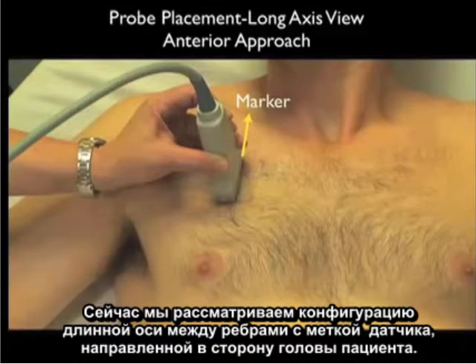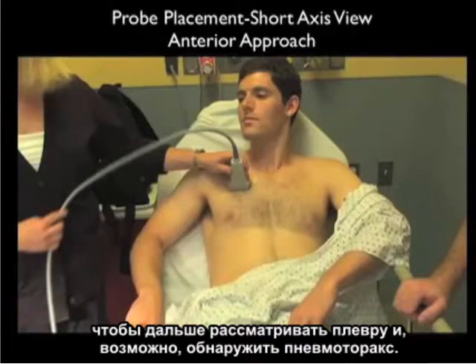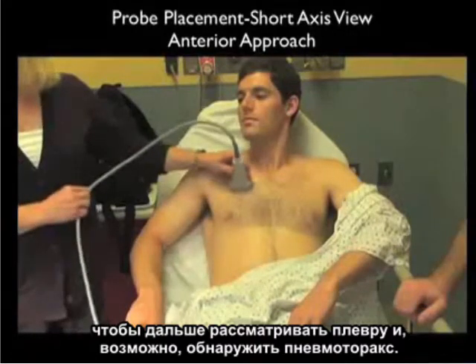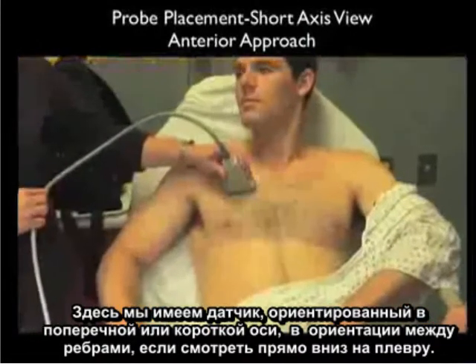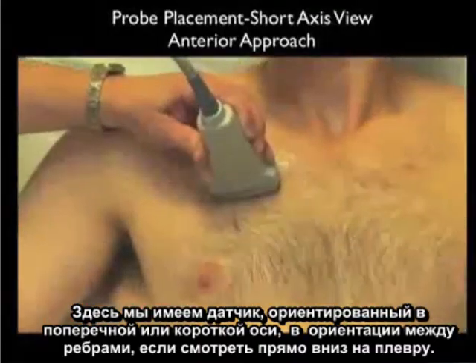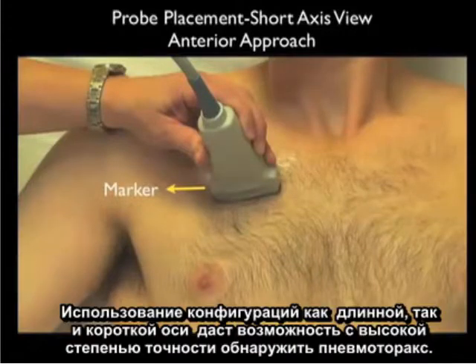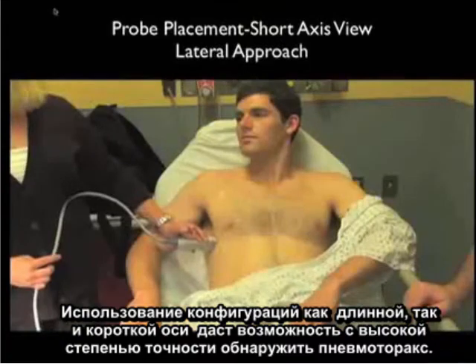Note we're looking at a long axis configuration between the ribs, with the marker dot oriented superiorly towards the patient's head. Once we've identified both the ribs and the pleura, we can swivel the probe into the short axis configuration to further look at the pleura and to detect pneumothorax. Here we have the probe oriented in a transverse or short axis orientation between the ribs, looking directly down at the pleura. Notice in this case, the marker dot is located towards the lateral aspect of the patient. Using both long and short axis configurations will allow you to detect a pneumothorax with a high degree of accuracy.